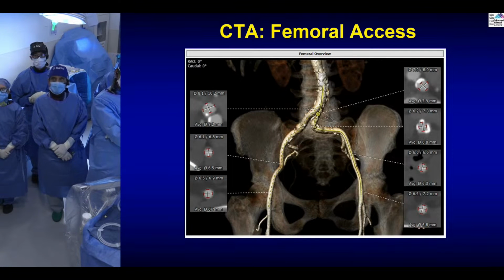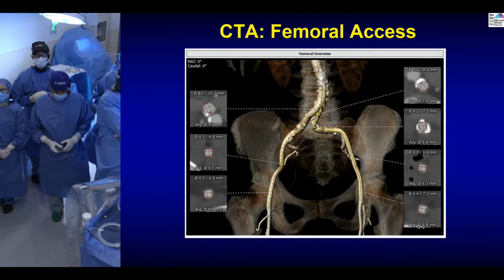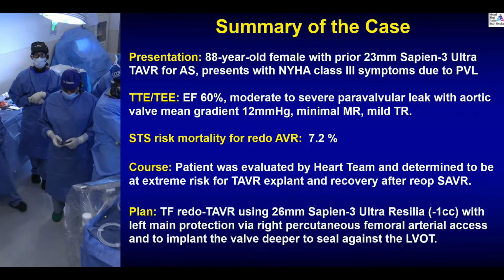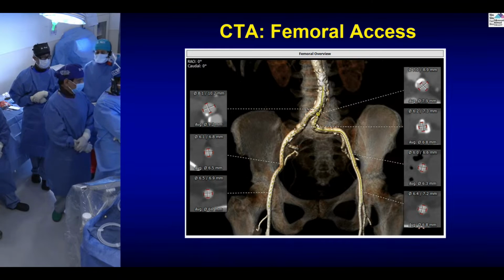After a few weeks, we see the patient again in the office. It may recoil and we may be back to the same situation. So I guess once we are already here, we should do a second valve despite having a good result with the balloon dilatation.